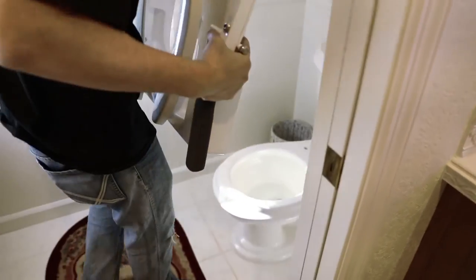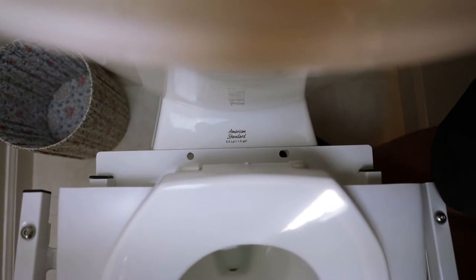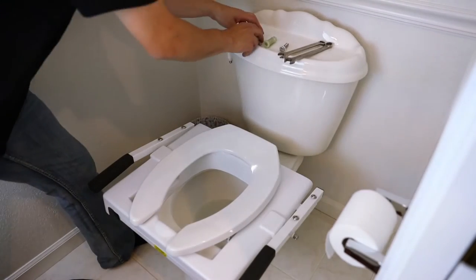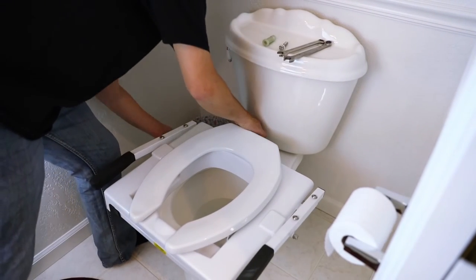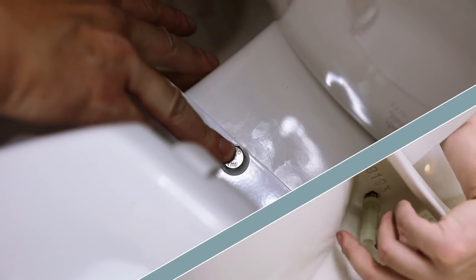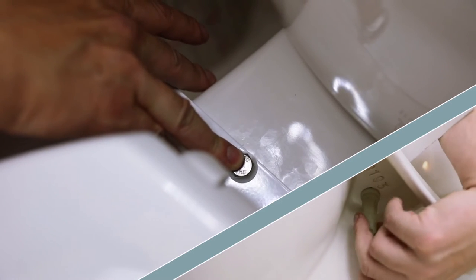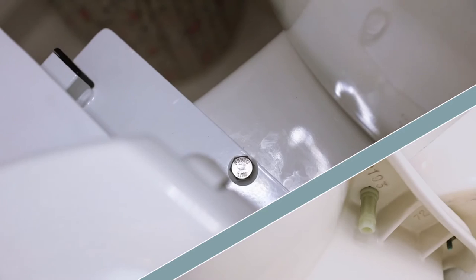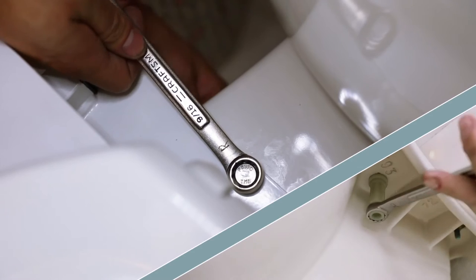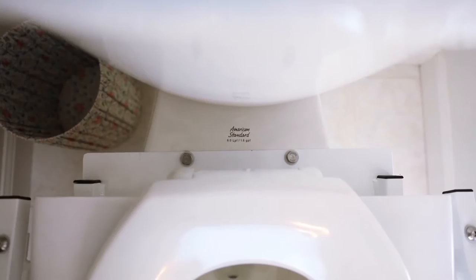Now bring in the tilt frame and set it in place on the toilet bowl. Using the hardware provided, place the mounting screw through the hole in the tilt frame and into the hole on the toilet bowl. Hold the top of the screw in place, attach the plastic nut to the bottom side of the screw, and begin finger tightening until snug. Using the 9/16 wrench, tighten the screw on top while tightening the plastic nut with the 5/8 wrench on the bottom. Repeat this process on the other side.